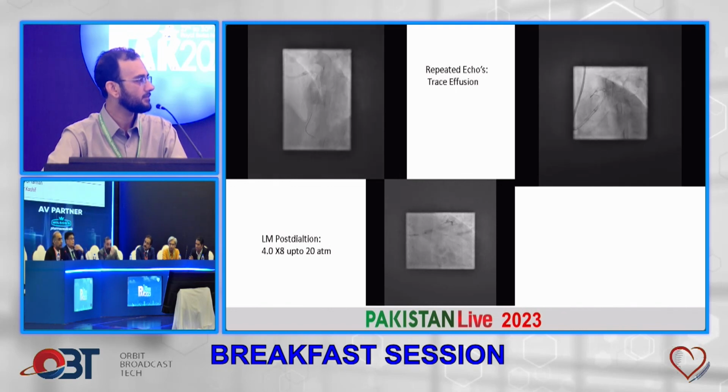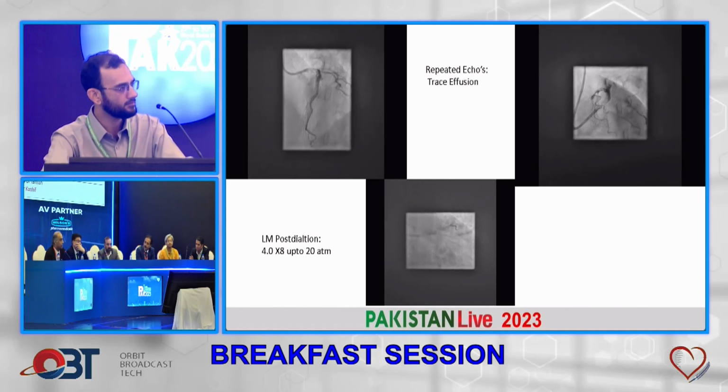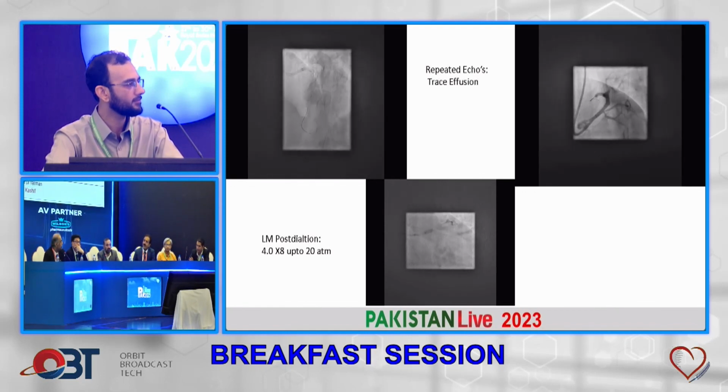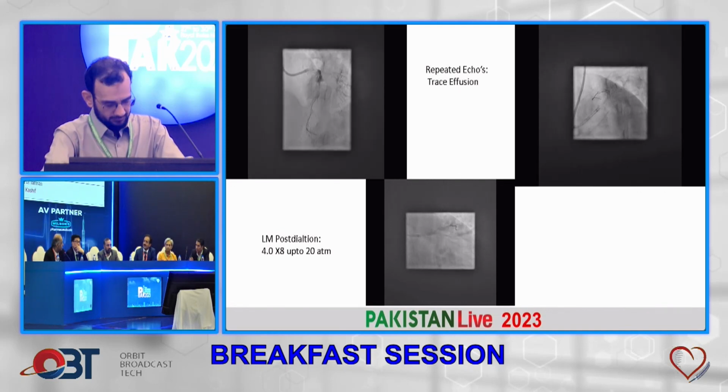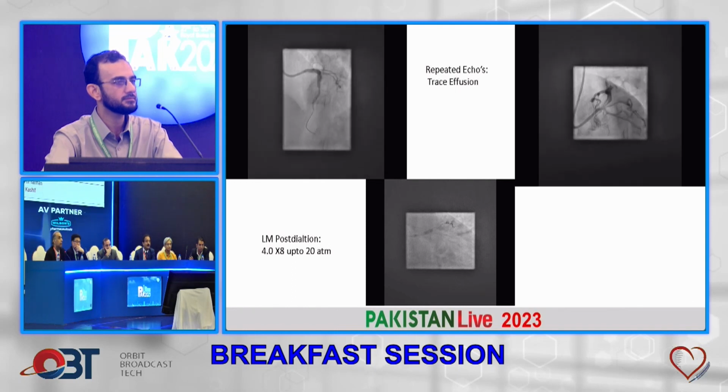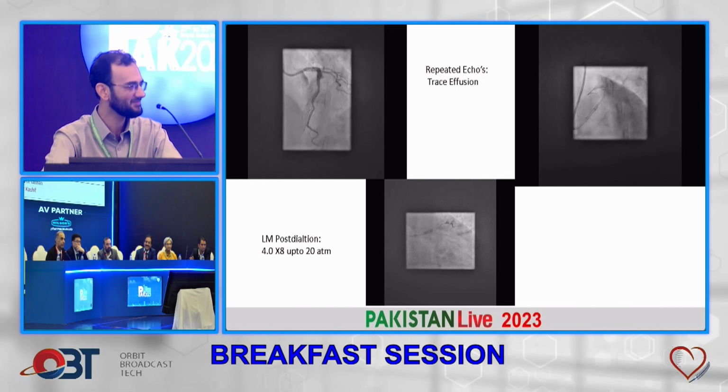It is at such moments that I am reminded by my seniors that there used to be a balloon called the perfusion balloon. Yeah, I have used that. We used to have one. I don't think it exists anymore. So that is something one can always request the industry to rethink. The reason is that people thought that although it is called a perfusion balloon, the perfusion really going through that balloon is so small that it's not significant, and that's why they abandoned it and don't even make it anymore. Which one? Triumph. Okay. It's available in Pakistan? Oh, yeah. Okay, good.